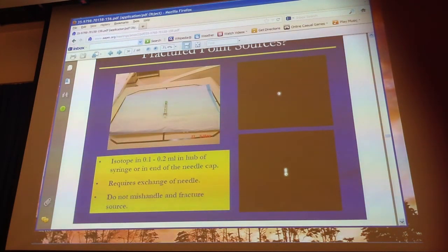This is not one of the things I was looking at here, but let's say that I had a radiopharmaceutical that had 2 energy peaks. Just ignore the stuff on the left here for a minute. What do you think would happen if you saw this? Let's say that you do a picture of indium. Here's camera 1 and here's camera 2, or here's head 1 and head 2. What would this tell you? Contamination of thallium?